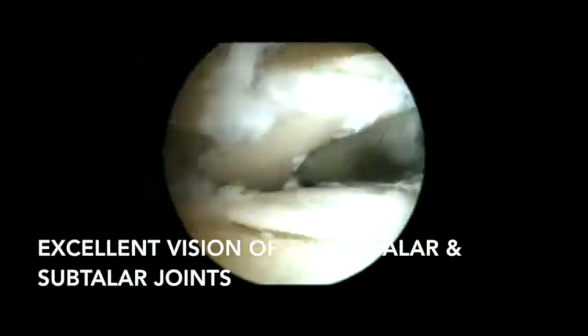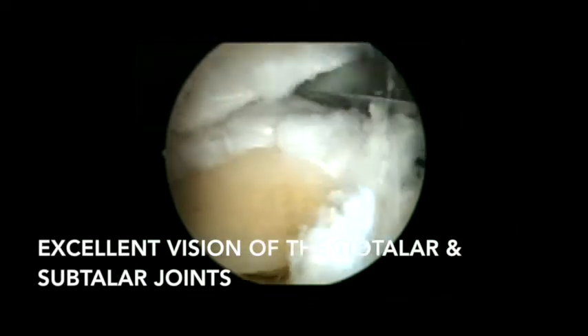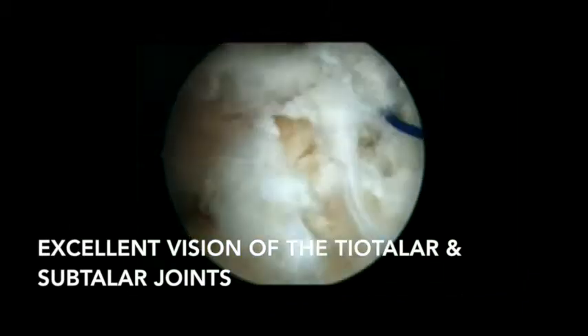The hardest part to access is the anteromedial portion of the posterior subtalar joint. Sometimes a third portal in the sinus tarsi is necessary to complete debridement of the anterior aspect of the joint. This provides an excellent view of the posterior subtalar joint.